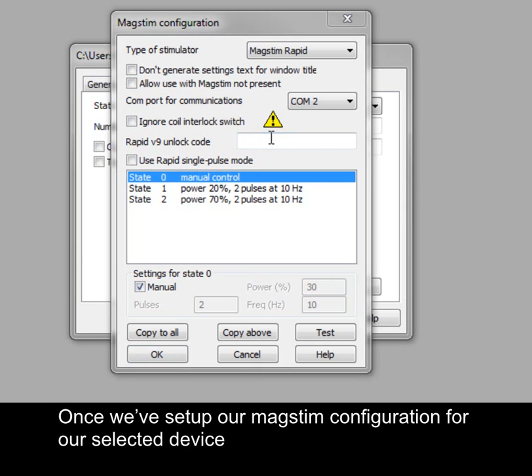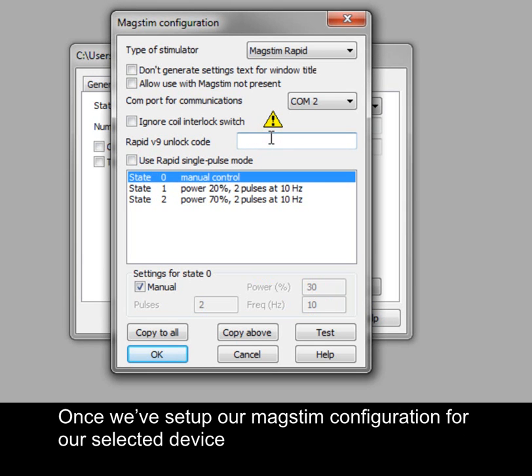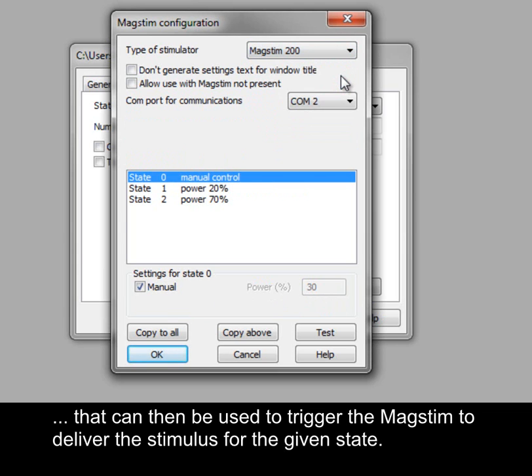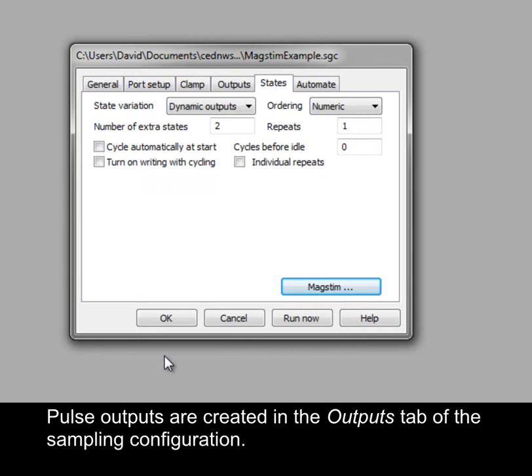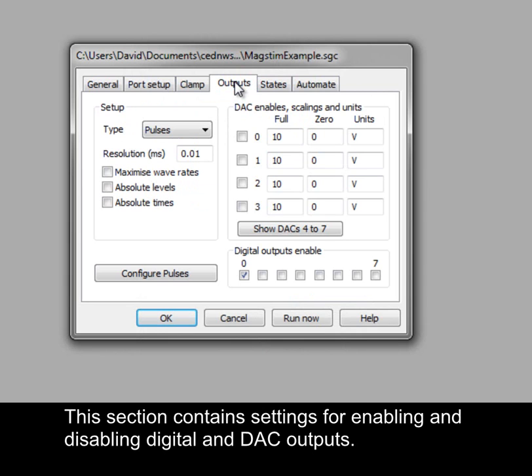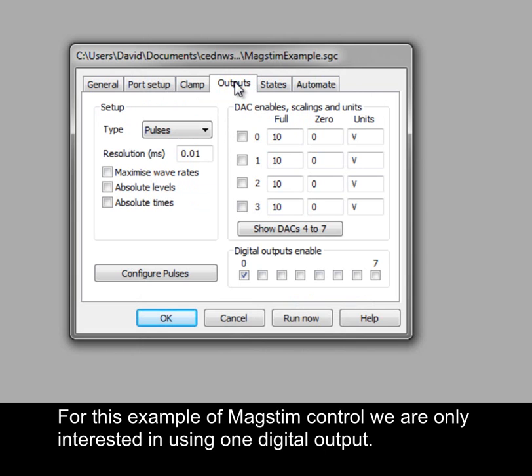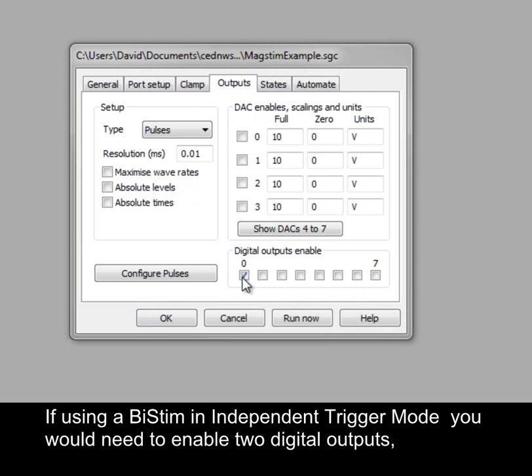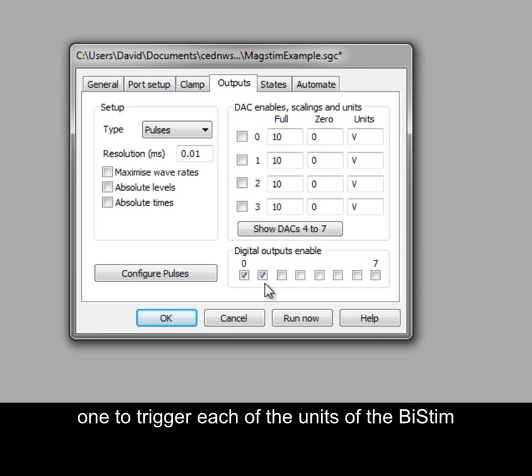Once the MagStim configuration has been set up for the selected device, the final requirement is to set up pulse outputs for each state to trigger the MagStim to deliver the stimulus for that state. Pulse outputs are created in the Outputs tab of the sampling configuration, which contains settings for enabling and disabling digital and DAC outputs. For this example, we are only interested in using one digital output. If using a BiStim in independent trigger mode, you would need to enable two digital outputs — one to trigger each of the units of the BiStim.